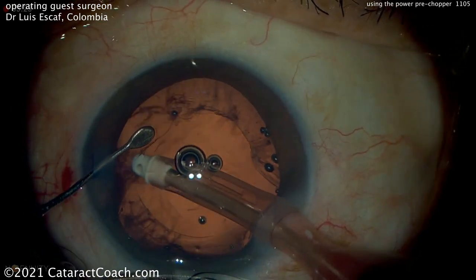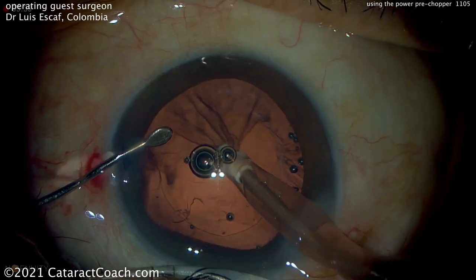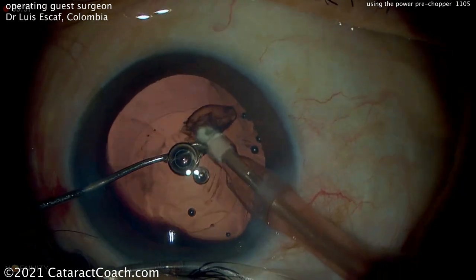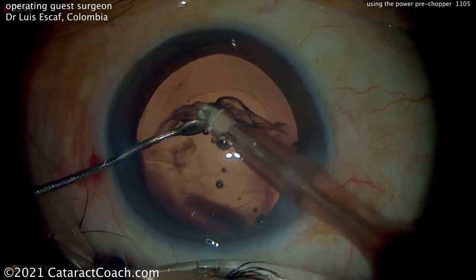Now cortical cleanup happening here with that polymer IA tip — nice and easy. The second hand is being used to just help fixate the eye, help the patient stay in that primary position. Makes it a little bit easier. And just care taken to very gently remove the cortex. And you can see it's a nice looking capsulorhexis, and this lens is going to go in the bag very easily.